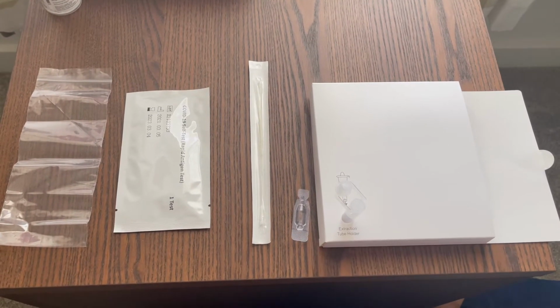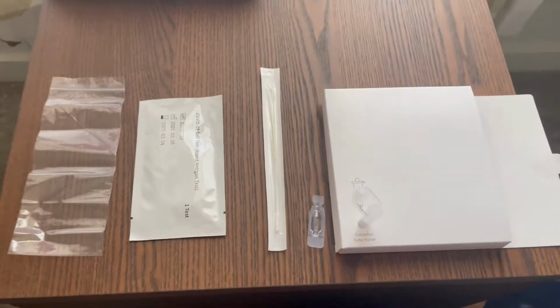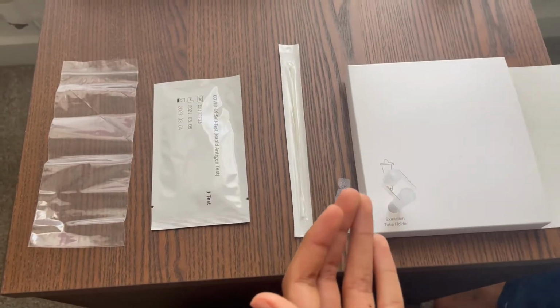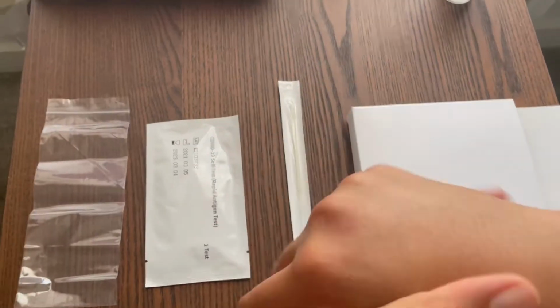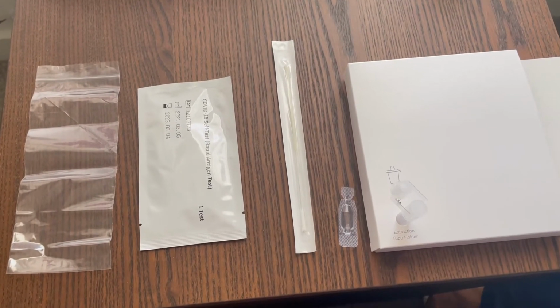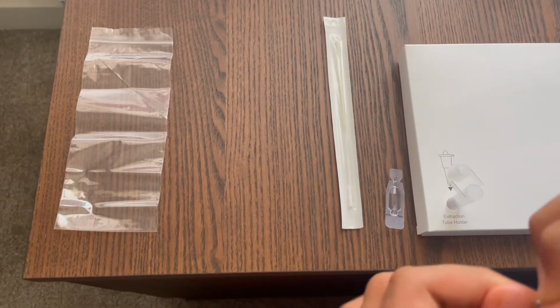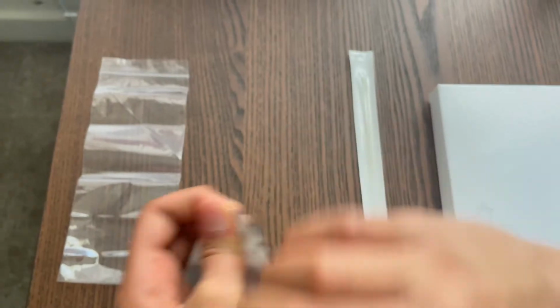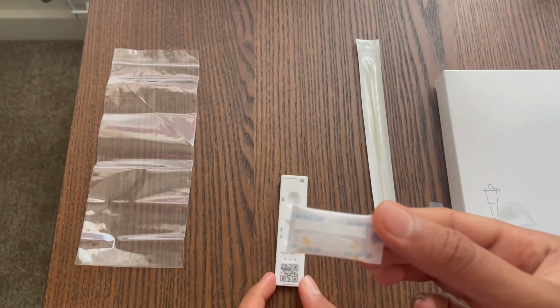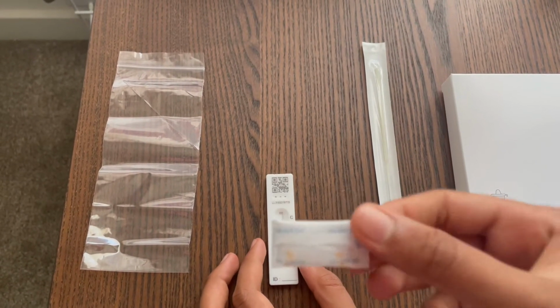So now I'm going to sanitize my hands once again to stop the risk of contaminating the test kit. So take a bit of sanitizer, apply it on, and sanitize your hands thoroughly. Okay, now that's done, we need to take the test kit out of the bag and put it onto the surface. I've got a desiccant bag there, and we can just throw this in the household waste. It's just so that it does not get any moisture of any kind. So let's just throw that away.